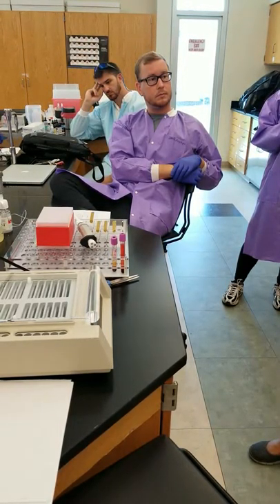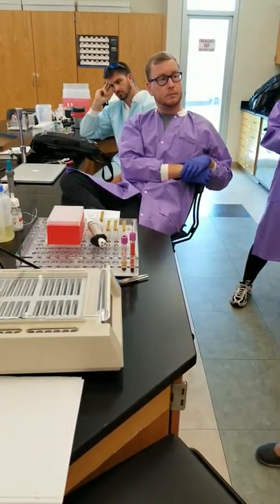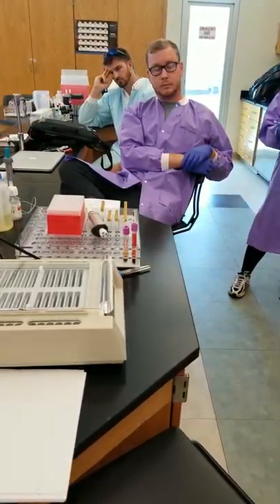But as you can tell, there are very, very small volumes associated with this. So you can't leave it open for very long because it will evaporate. So if you hold that thought right now, I'll be right back.